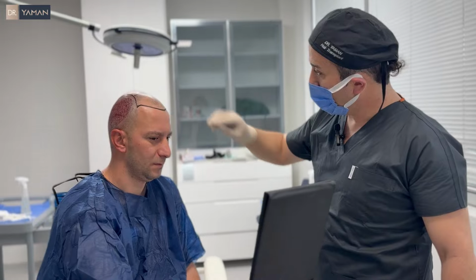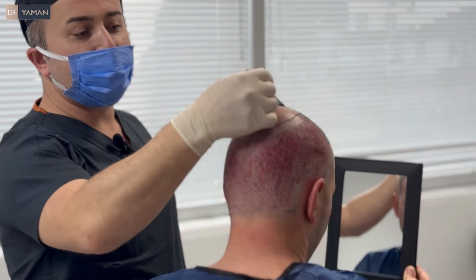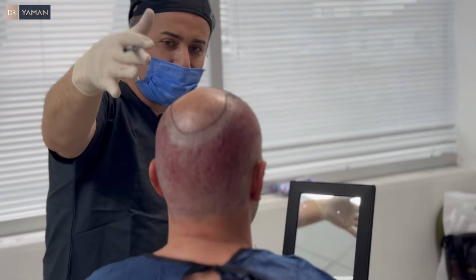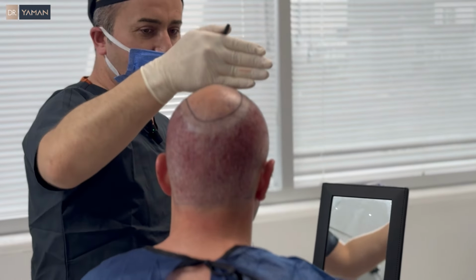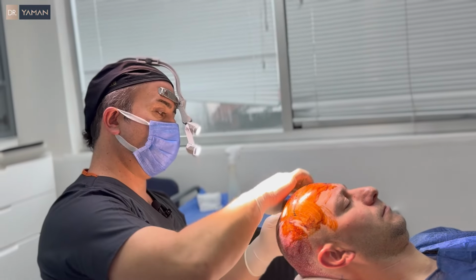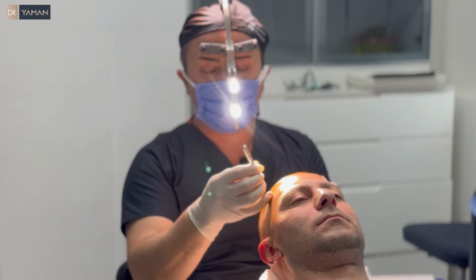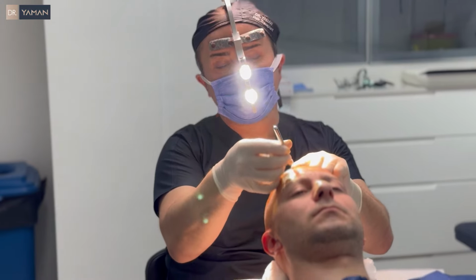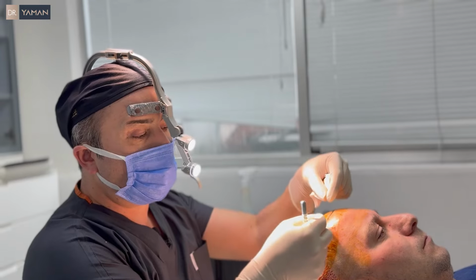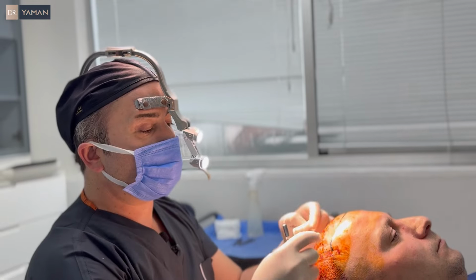It's important to have a little bit of existing hair in the transplanted area, and we'll put some grafts on the crown. Yeah, it will be a little bit darker than this, but not the same density on the crown. I will start opening holes on this part, and I will arrange his hair direction and angle with our micro holes, and then we'll use the Yaman implanter to implant the hair grafts.